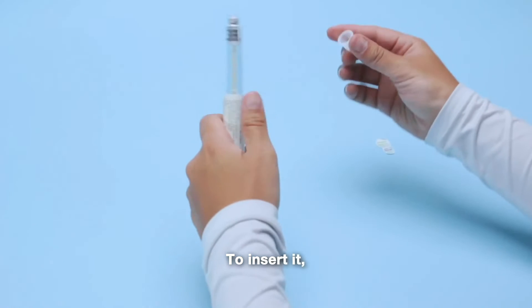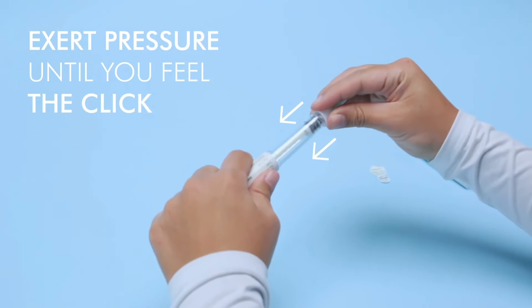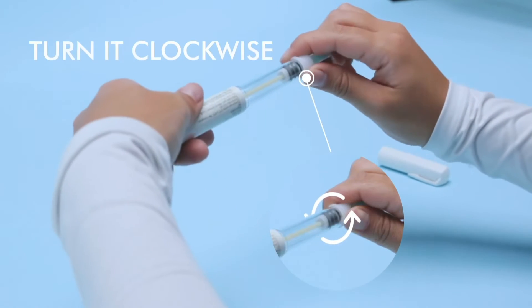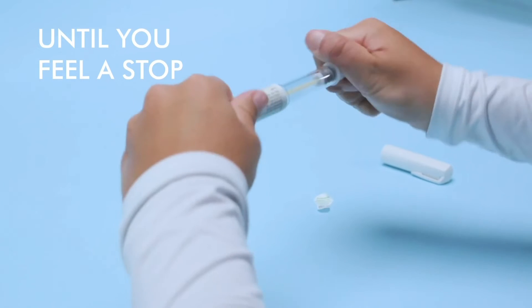To insert it, exert pressure until you feel the click that indicates that the needle has been correctly inserted, and turn it clockwise until you feel a stop.